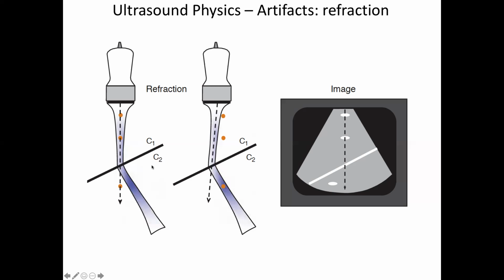And then when I rotate my beam such that I'm off on this line, I now get an echo from this spot, and it's going to erroneously believe it came from here. So it's shifted it over. When I make the 2D picture, this object, which actually is here, shows up over here. And so that kind of distortion with all these angular boundaries can cause issues.